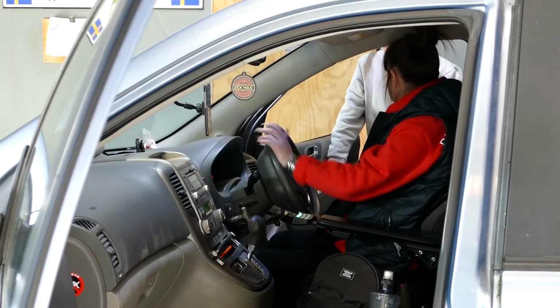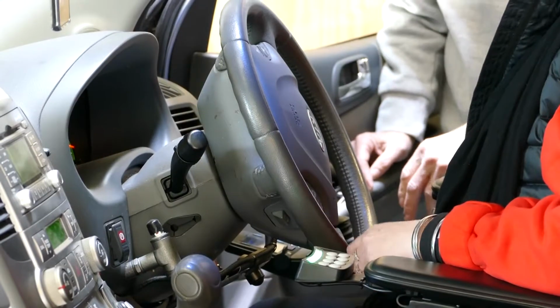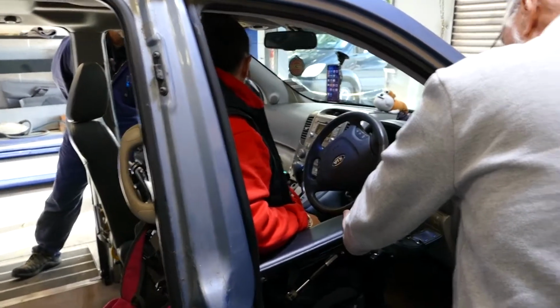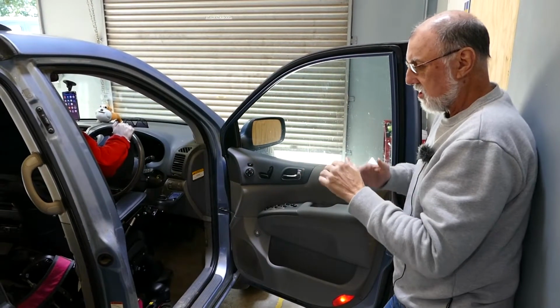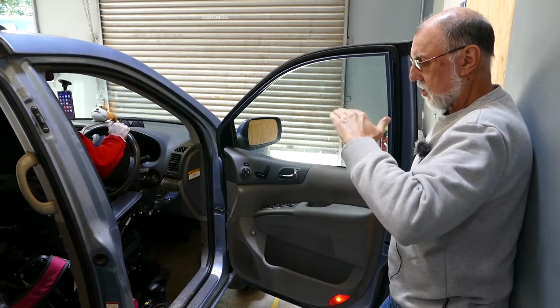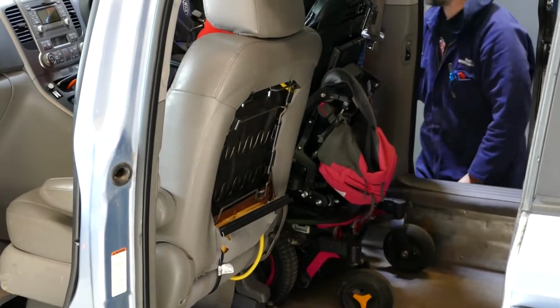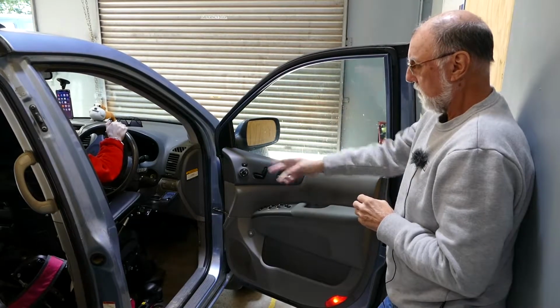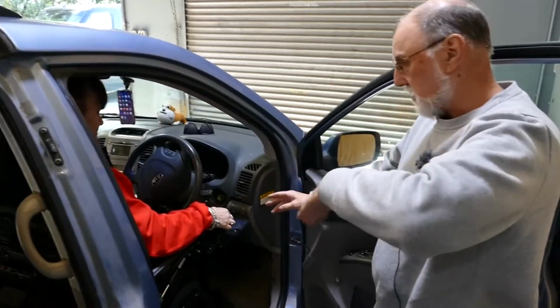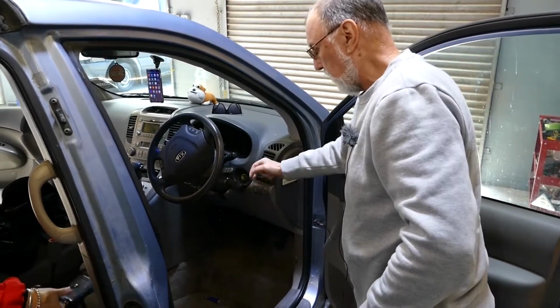We've changed brands of power chair, and it means the position that Tony drives in relation to the steering wheel is different between the two chairs, so we need to move the docking system on the floor of the van so that it matches the correct driving position. And then we also need to make a slight adjustment to the controller of the power chair, because right now, even with it dropped down out of the way, it's in the way of the hand control for acceleration.